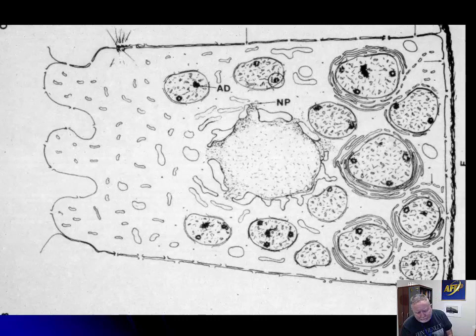Now, in the last number of years, there have been a number of changes to the nomenclature, and we have identified a second way, and they've been subdivided, but I like to keep it fairly simple. You have necrosis, which is usually a pathologic change due to injury of any number of types.